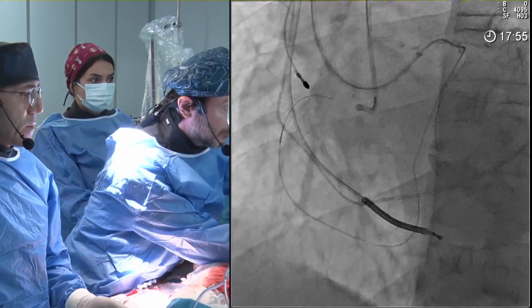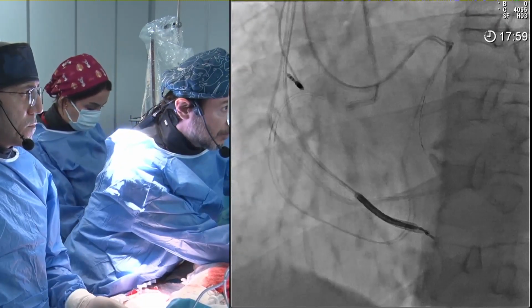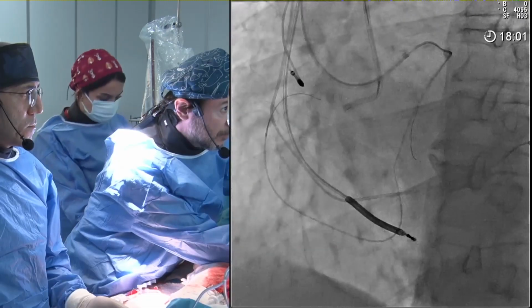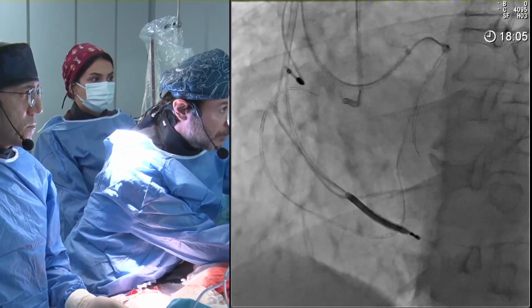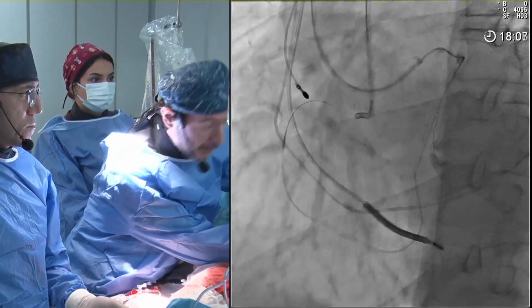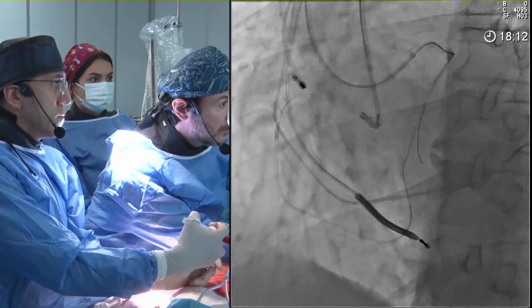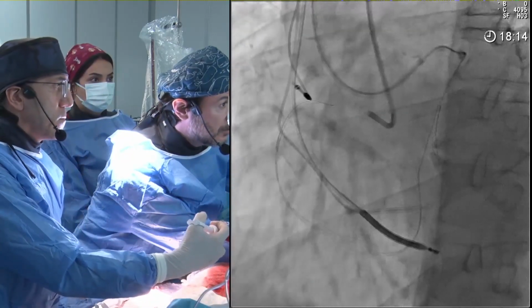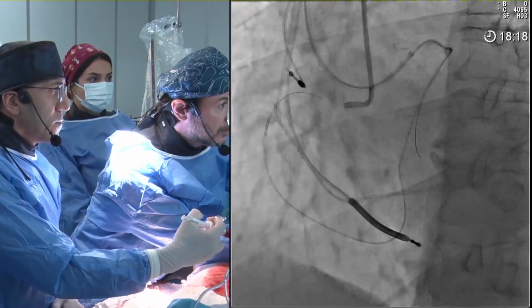The second thing here is, I think the retrograde wire is in the architecture of the vessel, and yes, if they can do retrograde Carlinos, get the microcatheter around and puncture into the aorta with a stiff wire, the routine externalization, snaring, etc. But if you're not able to do that, we must not overlook the fact that you can use CART. So if you puncture antegradely, you need a target. Right now, you don't have a good target.